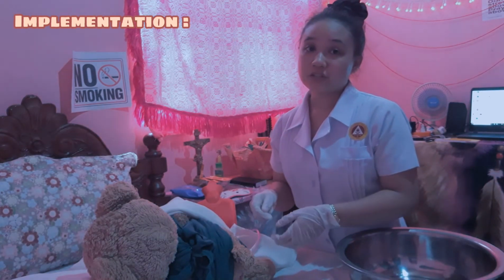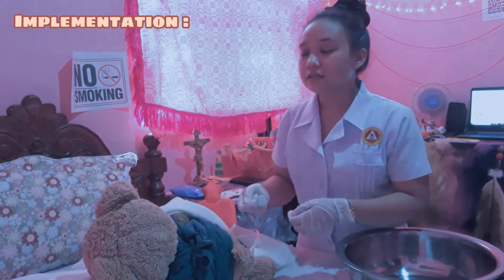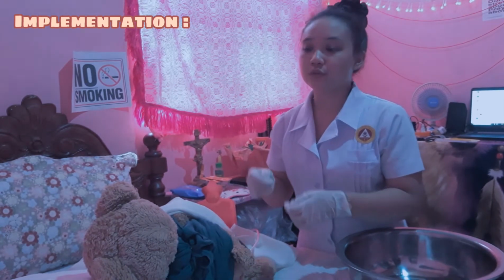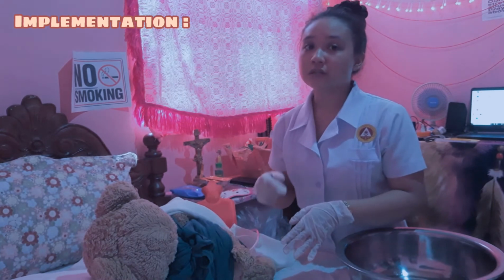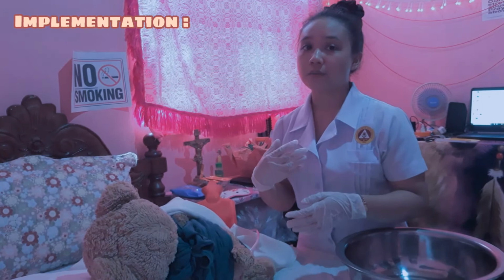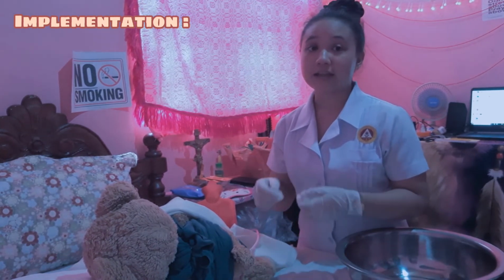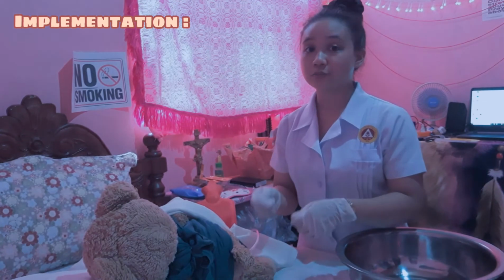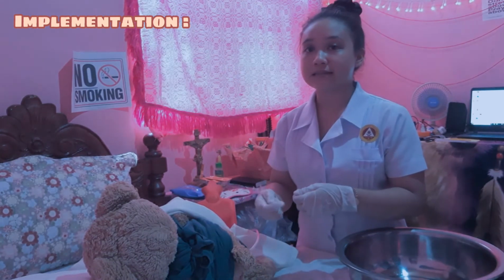While administering the fluid slowly, if the client complains of fullness or pain, lower the container or use the clamp to stop the flow for 30 seconds and then restart the flow at a slower rate. If you are using a plastic commercial container, roll it up as the fluid is instilled.